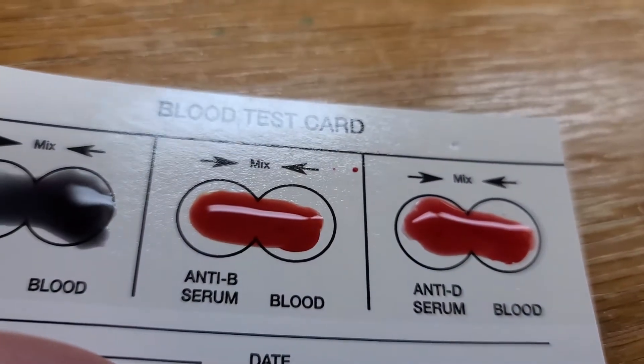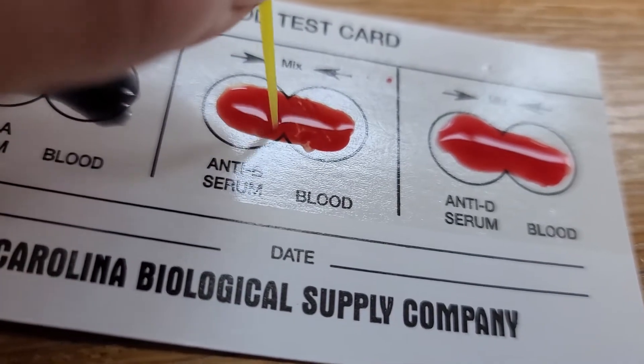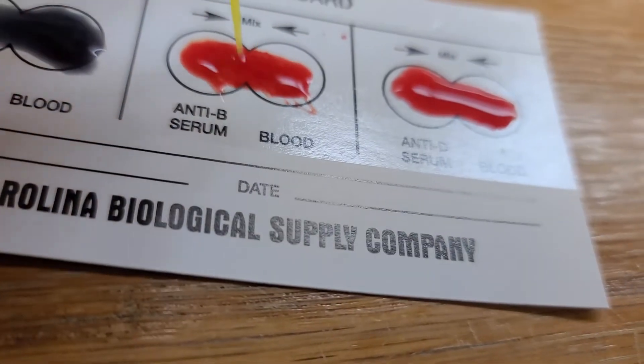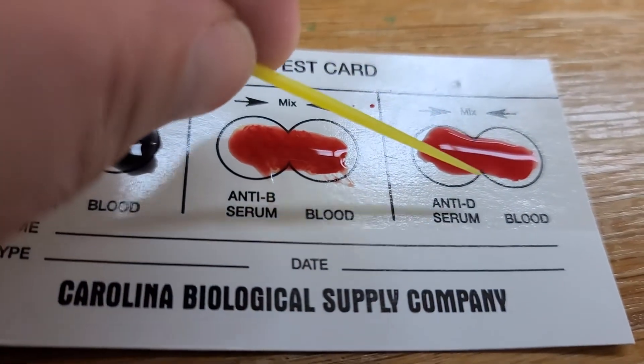I think it was definitely bleeding a lot more than yours. It kind of looks like it's clumping a little bit. Do you actually know your blood type? No? Because it looks like B positive right now.